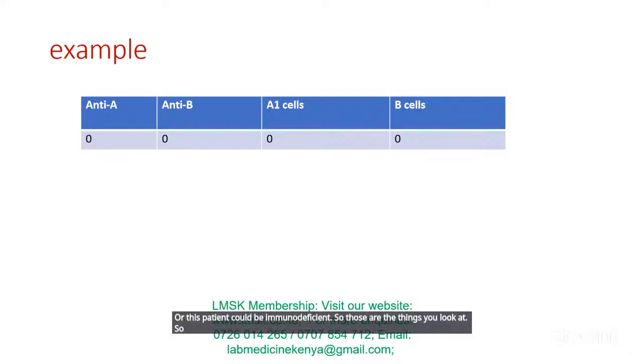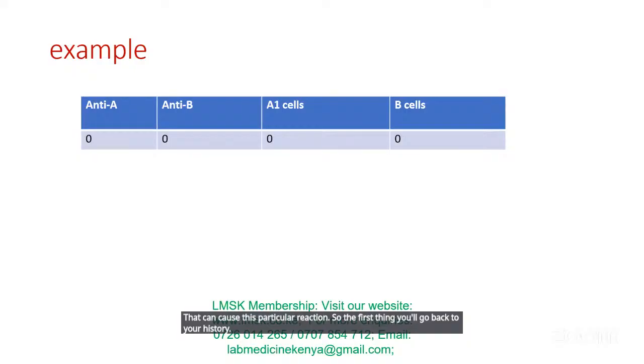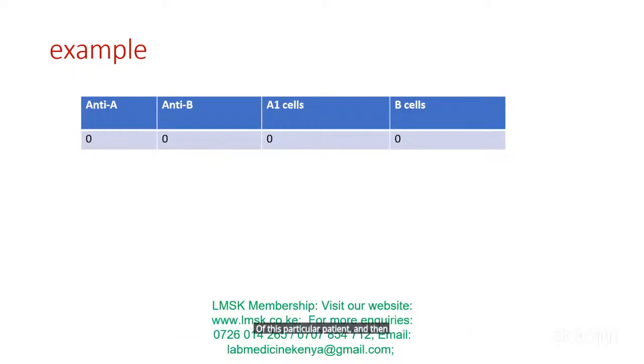So how are you going to deduce which of the many possible causes produced this particular reaction? The first thing, you'll go back to the history of this particular patient, and with the history, you are able to resolve it.